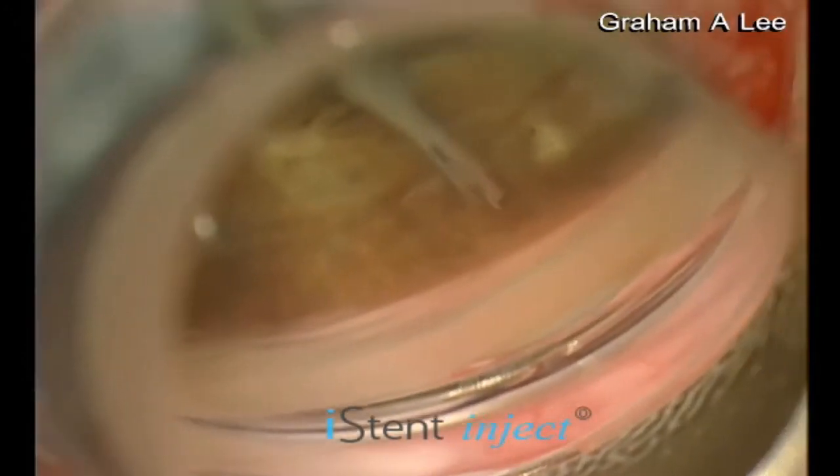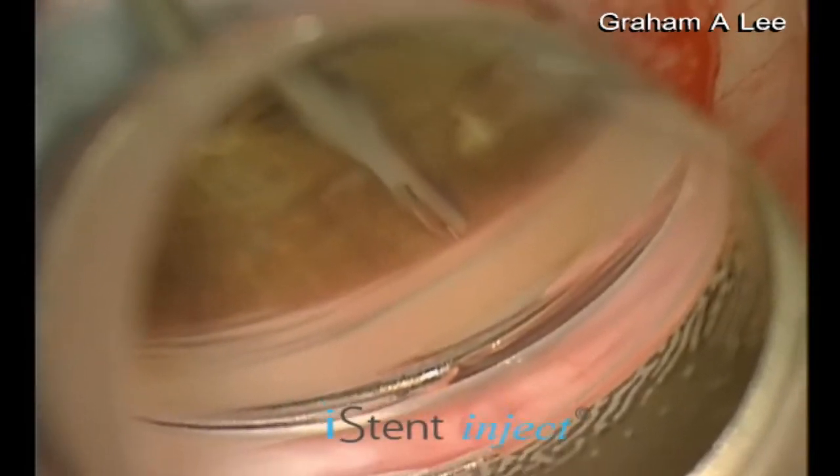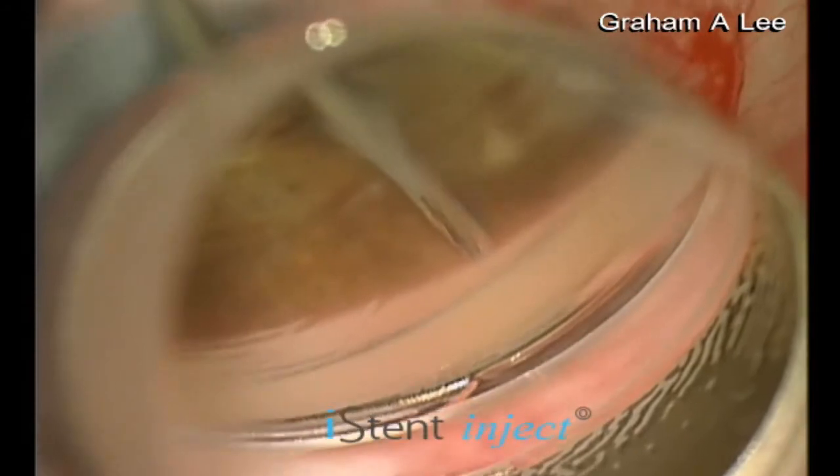Approximately two clock hours away, preferably aiming for an aqueous vein, the trocar is centred on the trabecular meshwork and the blue button pressed again to deploy the second shunt.